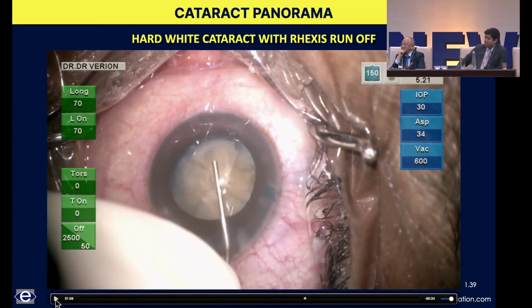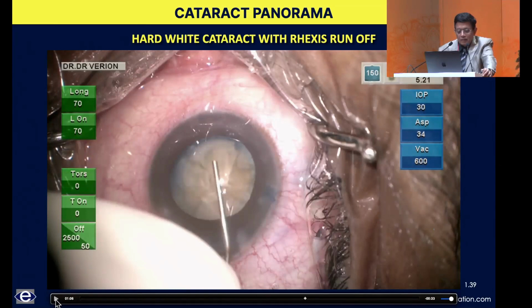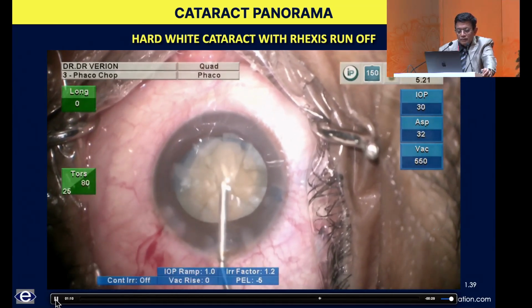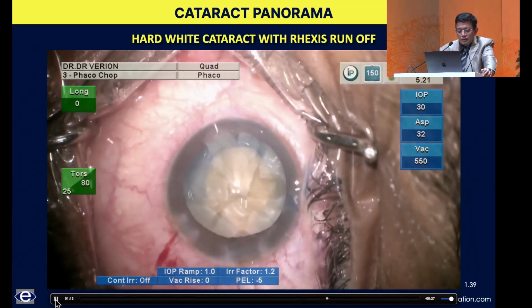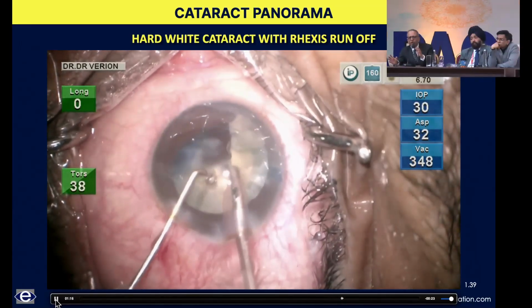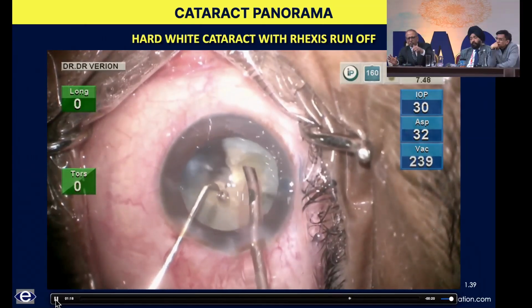Yes, Rohit, you are the master here. No, I think Dr. Shreyas has been spot on. Basically, a horizontal chop is what should be the preferred one, no vertical chop whatsoever. The separational forces should not extend right to the sub-incisional part.